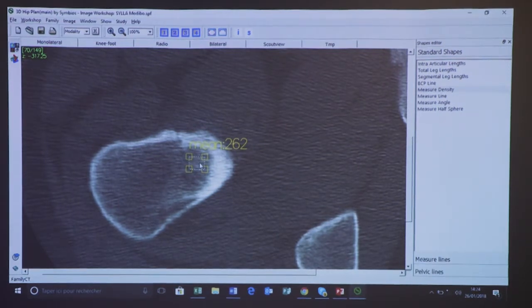For sure, I will prepare for this patient a motorized reaming procedure with flexible reamers, and probably I will also use a flexible guide, in order to be sure to stay inside the femur. It's very easy, especially when we use a direct anterior approach, whatever it is, on a traction table or standard table, it's very easy to create a false route in such a case.